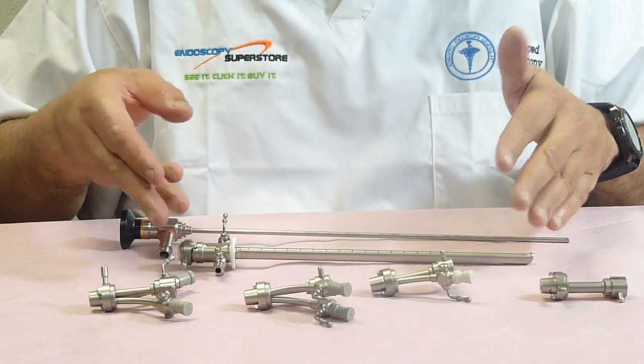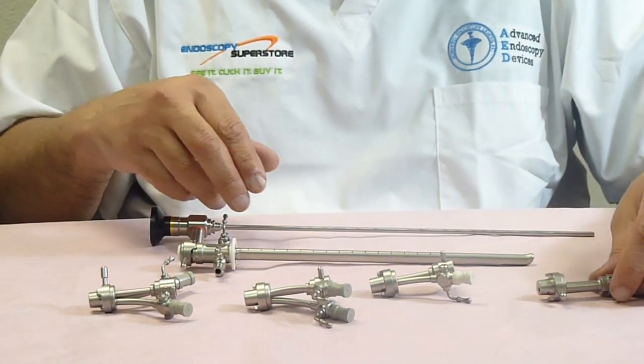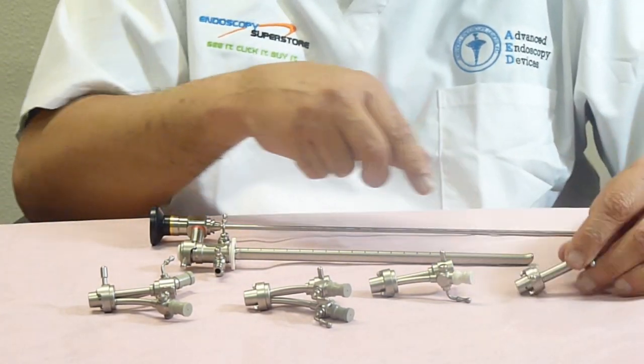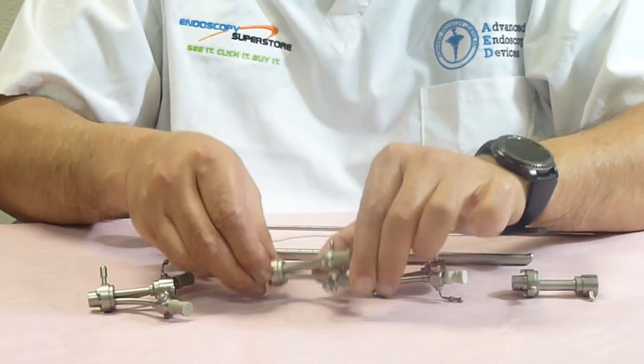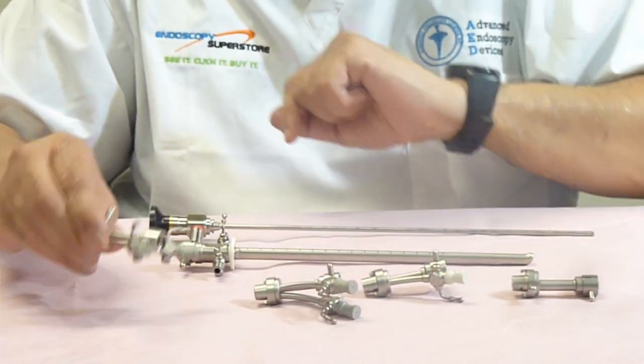We have four different bridges available for our sheaths. We have a standard bridge which has no channels, we have a single channel bridge, we have a double channel bridge, and we have a wide-spread double channel bridge.